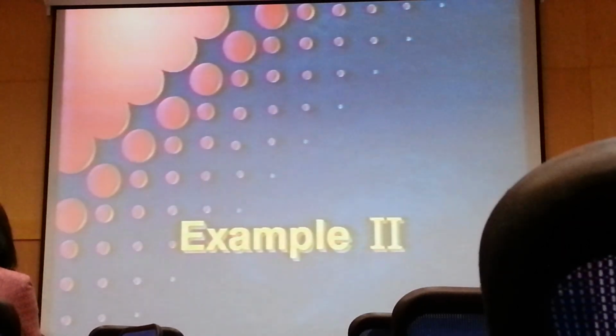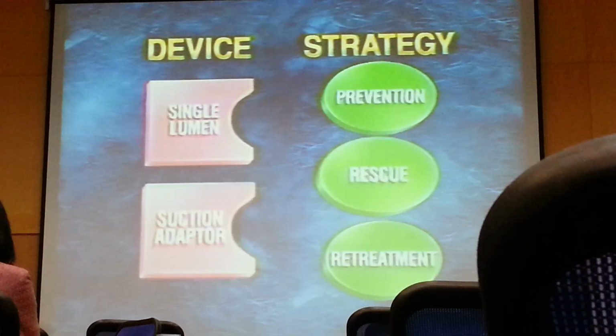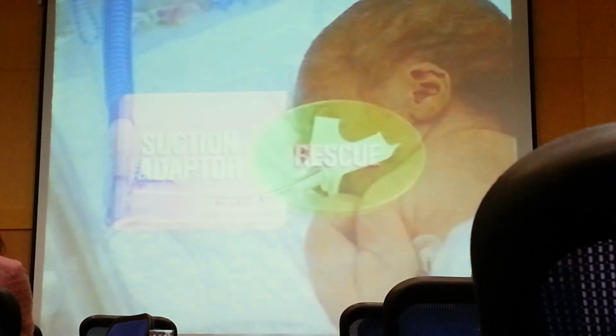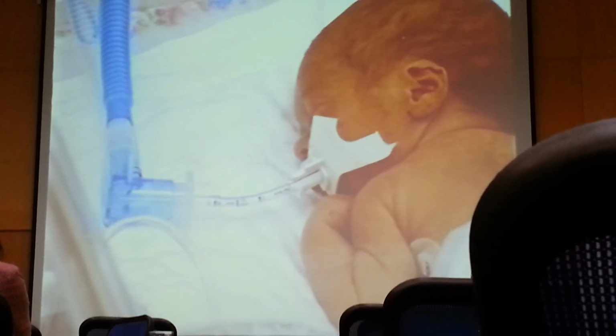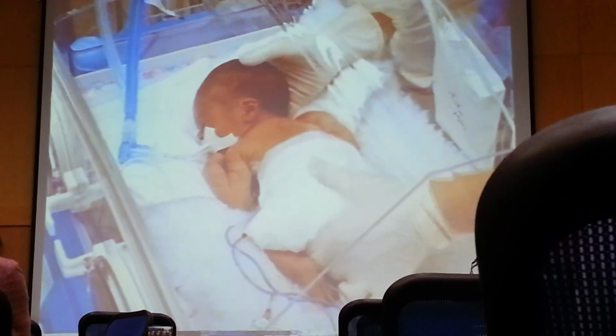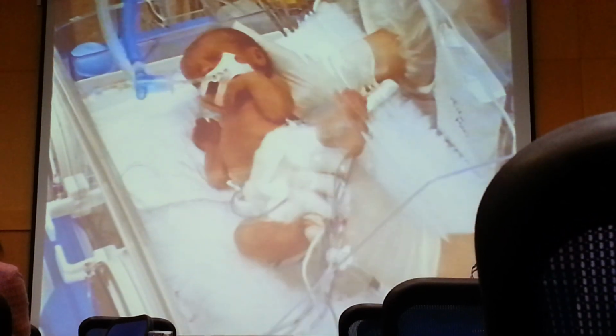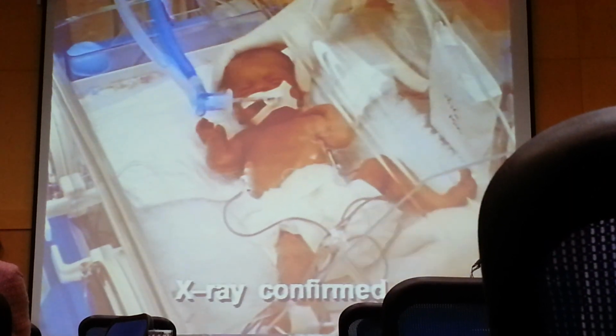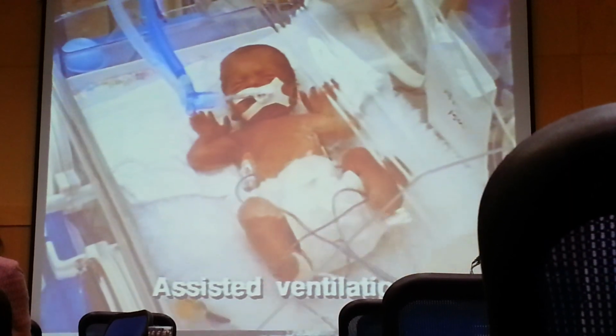For this infant, the clinician has chosen to give Surfactant through a neonatal suction adapter in the rescue strategy. With a suction valve, ventilator support will not be disrupted during dosing. Infants with confirmed respiratory distress syndrome may be treated using the rescue strategy. RDS should be confirmed by X-ray and be severe enough to require assisted ventilation.